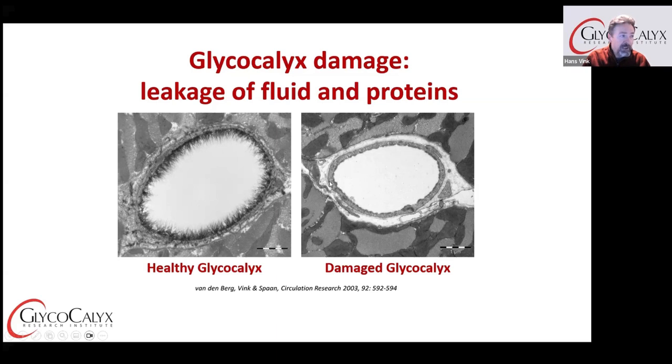And at the same time, you see all this white space now developing on the outside of the capillary, in between the outside of the capillary and the tissue cells, which is pericapillary edema, the leakage of a lot of fluid and proteins out of the capillaries accumulating in the pericapillary space, a lot of interstitial swelling, also compressing the capillaries, so they become a little bit smaller in diameter.